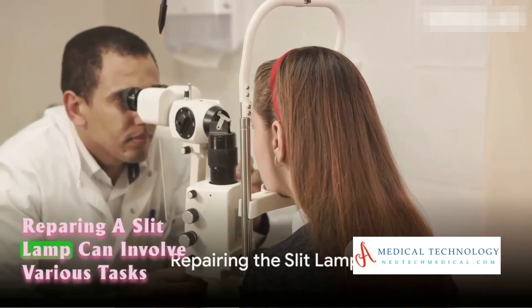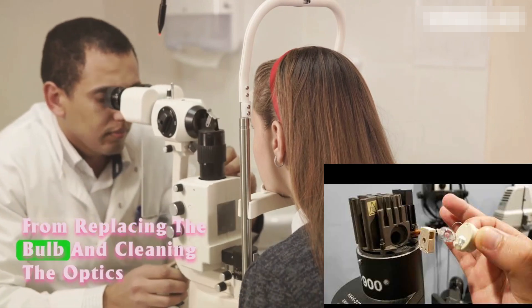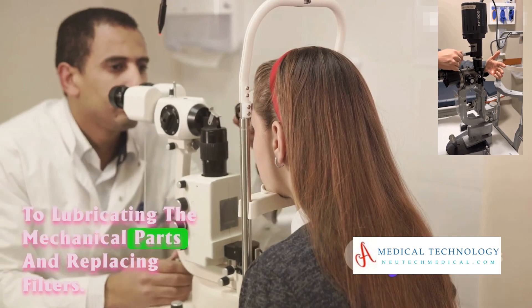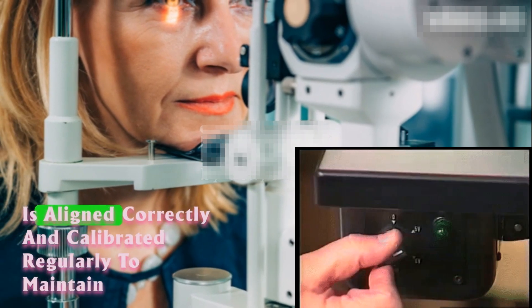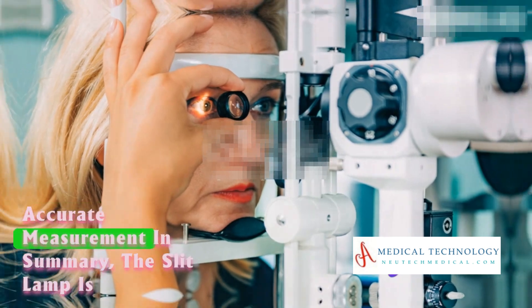Repairing a slit lamp can involve various tasks, from replacing the bulb and cleaning the optics, to lubricating the mechanical parts and replacing filters. It's also essential to ensure the slit lamp is aligned correctly and calibrated regularly to maintain accurate measurements.